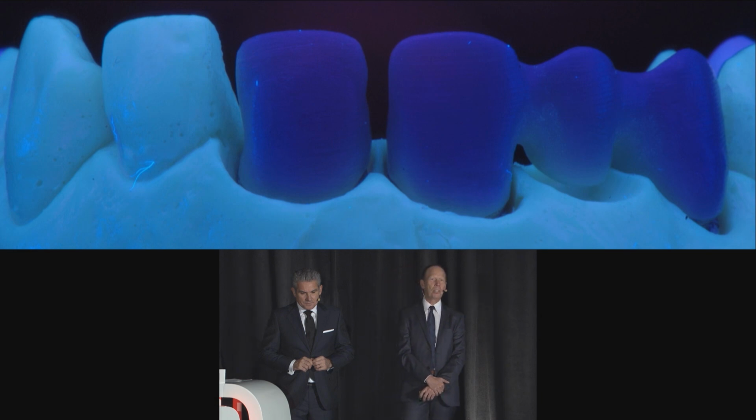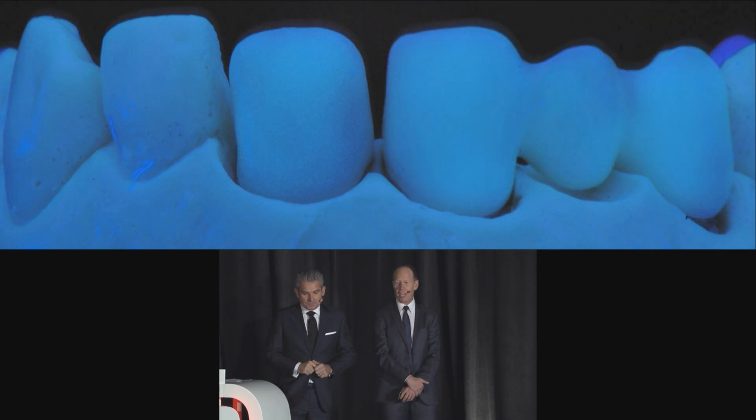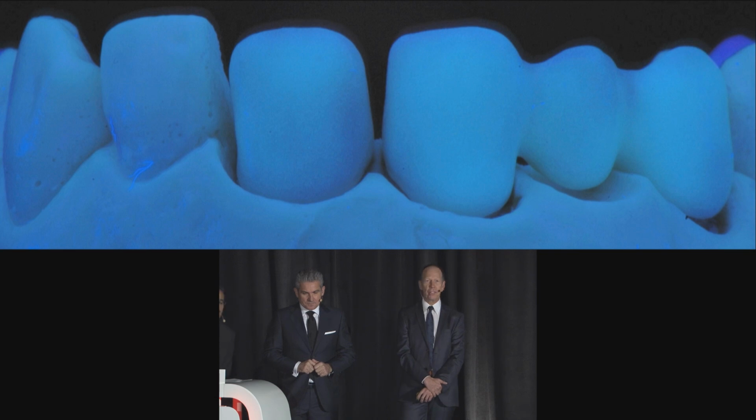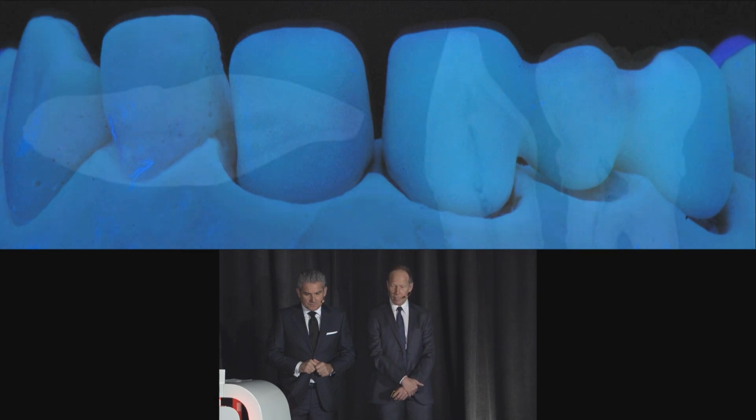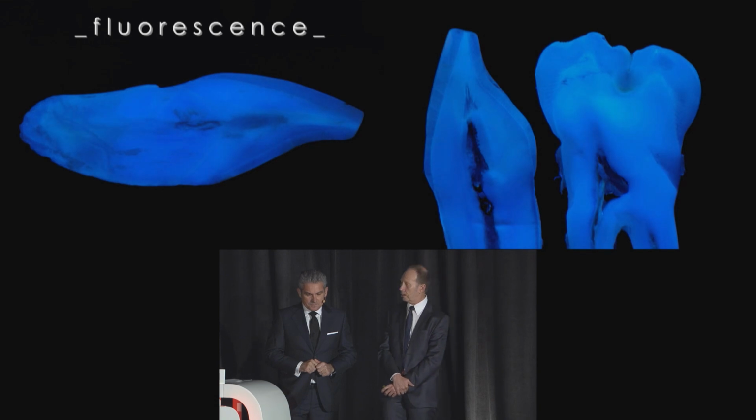Of course, when you put alumina and also zirconia under ultraviolet light, under black light, you can clearly see that there's the shadow again. So we cover the first layering with a fluorescent powder, which gives us a lot of light inside the restoration, and of course it brightens up the gingiva. Professor Blatz and Iñaki did a wonderful study, published in the Quintessence of Dental Technology in 2011, I think.